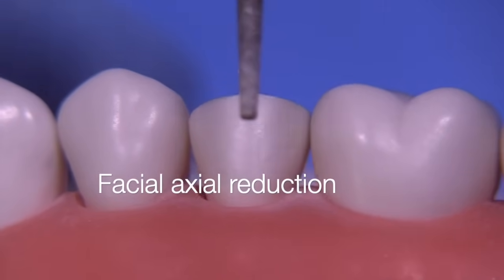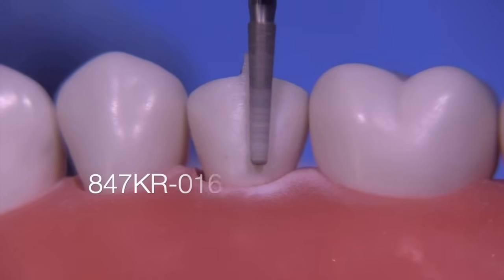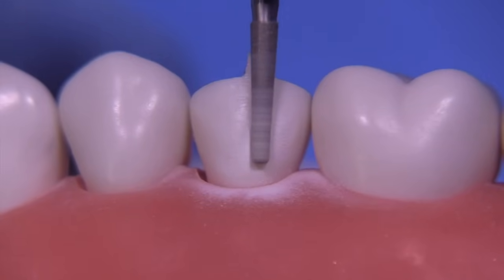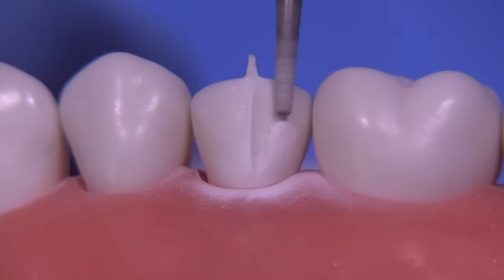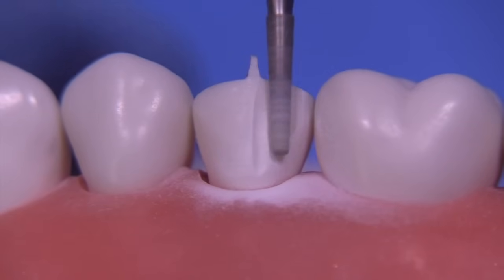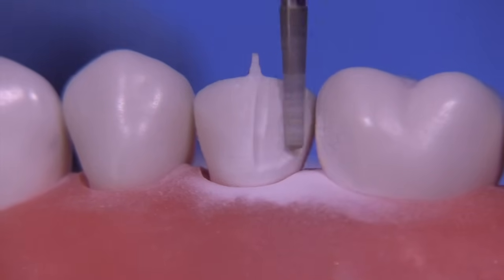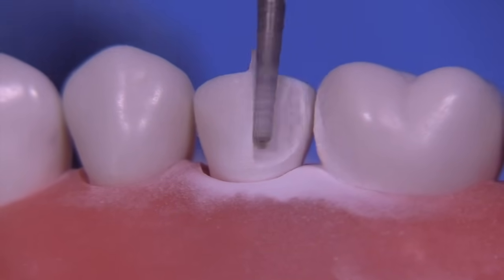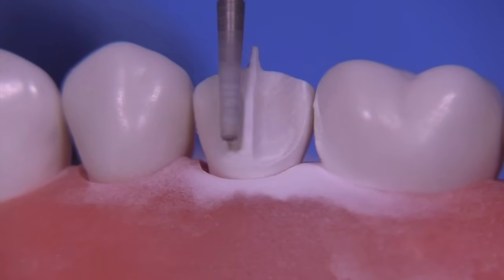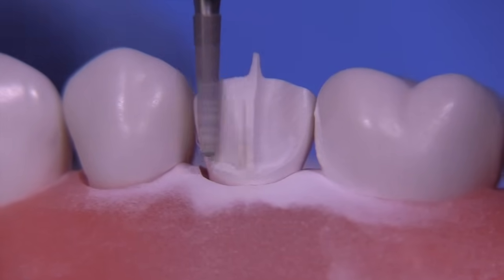On the facial, because this is a PFM, I'm going to use the exact same diamond, the 847 KR 016. We're going to extend this T-prep technique all the way down to the gingival. It's amazingly helpful to leave this little section unprepared in the middle.